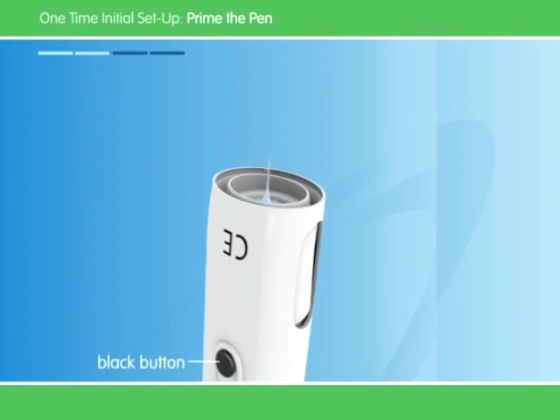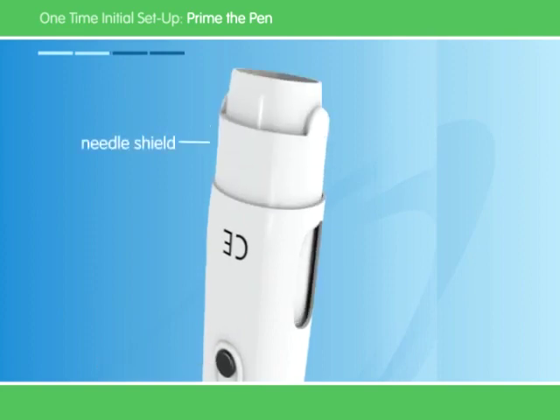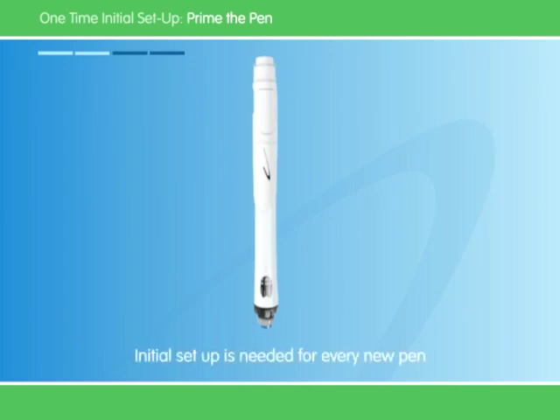Press the black button on the needle guard to release the needle shield. We're almost at the half point of the initial setup. Remember, you only have to do this once with every new pen.